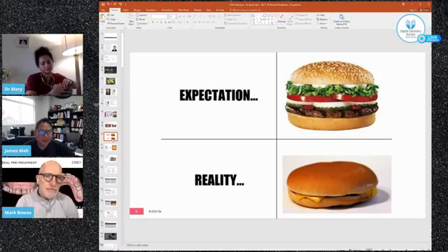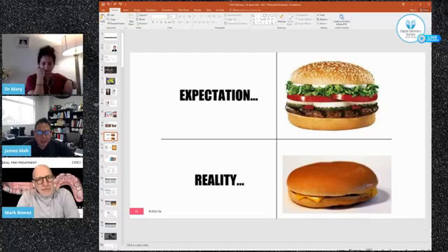Oh, completely. That's perfect. The idea that you simply take impressions, send them off, and then a series of aligners comes back and it's right for the person, that's not how it works. When you interview the person, you assess them, you take your records, you come up with a very detailed plan for them that's individualized.